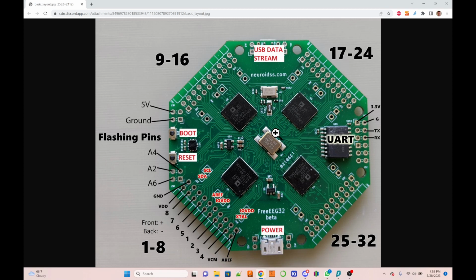Is that also? I think that this describes all of the channels, right? Yeah, I think so. If people forget, it's easy. You can see that the chip's been rotated 90 degrees. So when I was looking at it, I thought, well, you can see it's been rotated and flipped. So that would be how they must map. Exactly. It's just a rotation. It's not a mirror. It's a rotation.